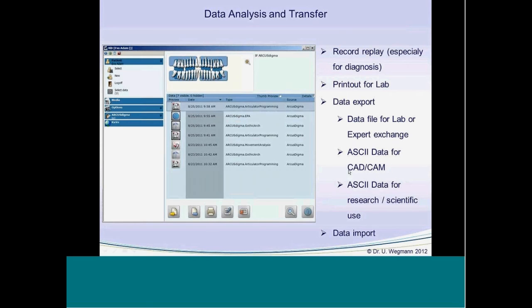And we can use this ASCII data file for research or scientific use. And of course, we can import data from other measurements done by another dentist so that we can discuss it.